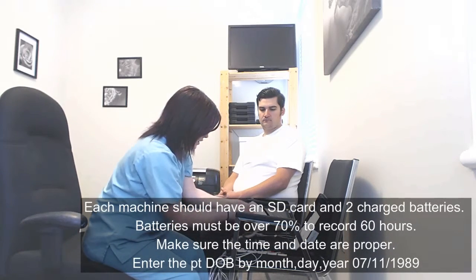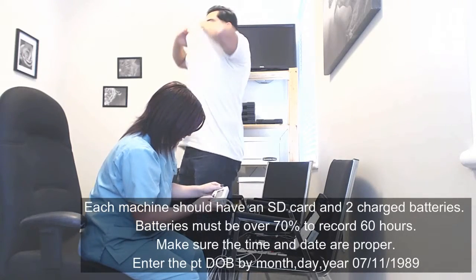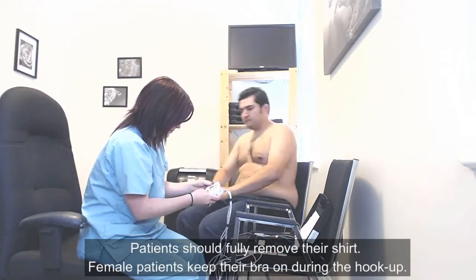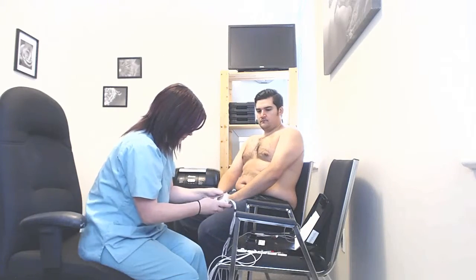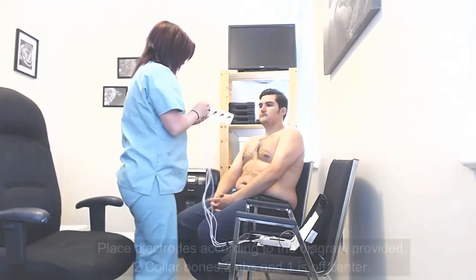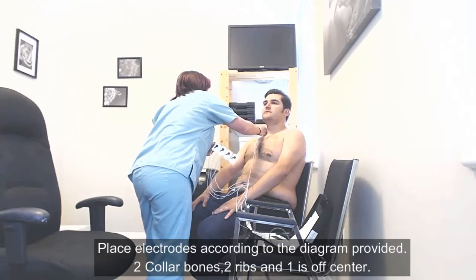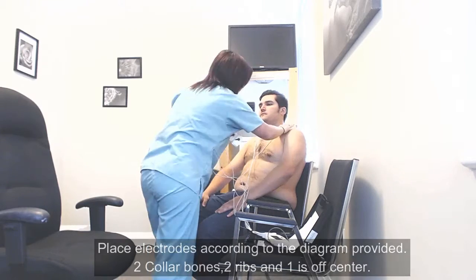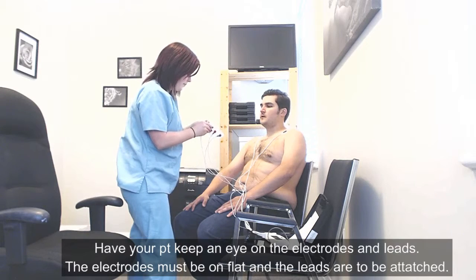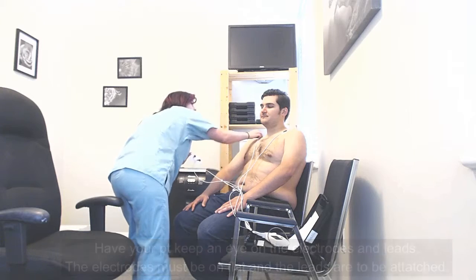On the machine, I am just going to enter in your birth date, and I'll get you to remove your shirt and have a seat. We are placing electrodes up by your collarbones — when you can press them back down and they won't stay, that is when you are going to want to change them. Also make sure that the leads are not popping off.